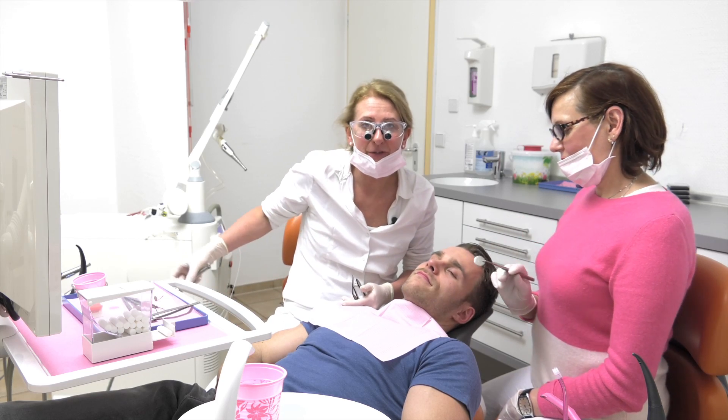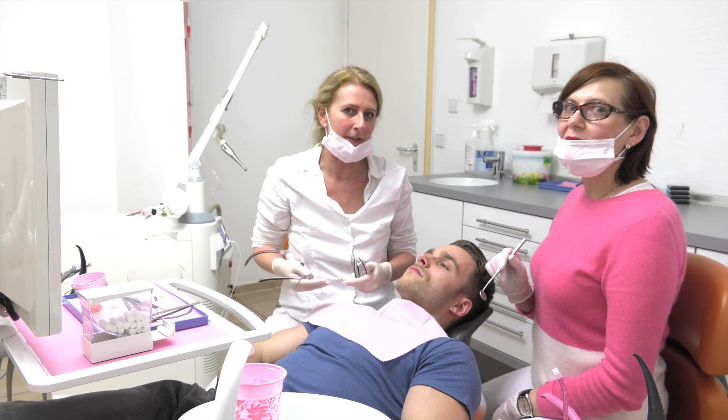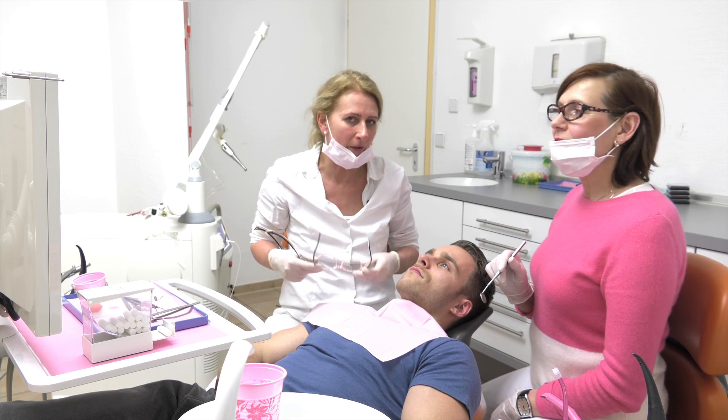We are just finishing our polishing and you can remember we cannot use the Erbium YAG laser for polishing on plastic fillings. So, we do have to use the ordinary drill.